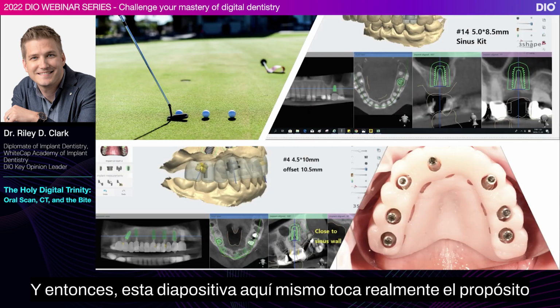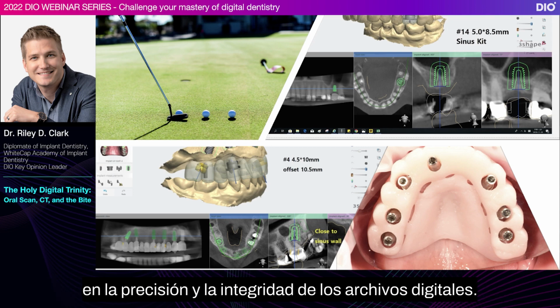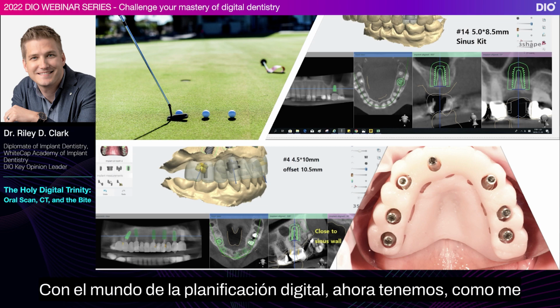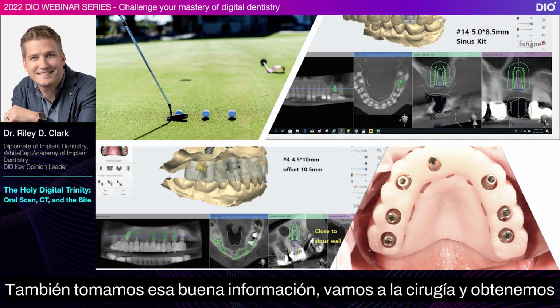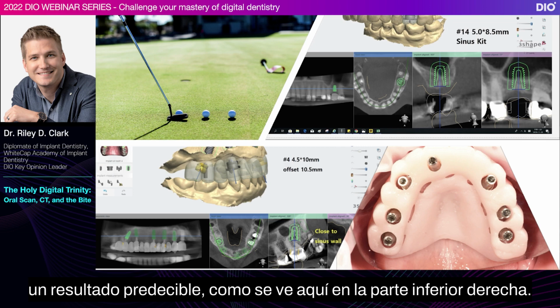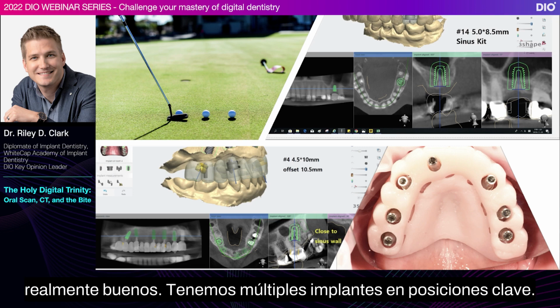And so this slide right here kind of touches on really the purpose why we do this. All of our digital planning is based on the accuracy and the completeness of the digital files. And so with the digital planning world, we now have, as I like to say, endless putts to try to hit that hole in one. We also then take that good information, go to surgery, and get a predictable outcome like you see here in the bottom right. That right there represents a lot of thoughtful planning from really good, thoughtful data.